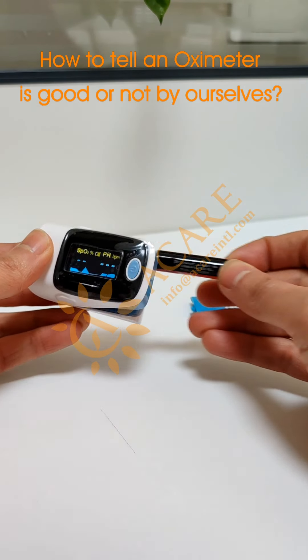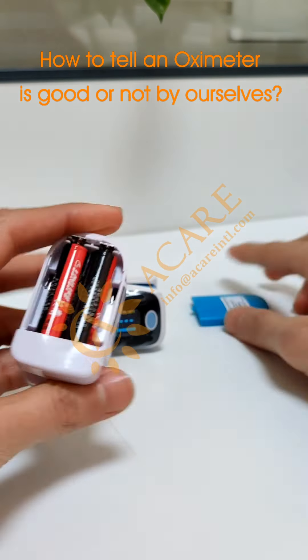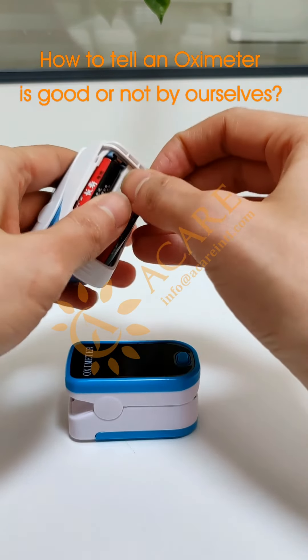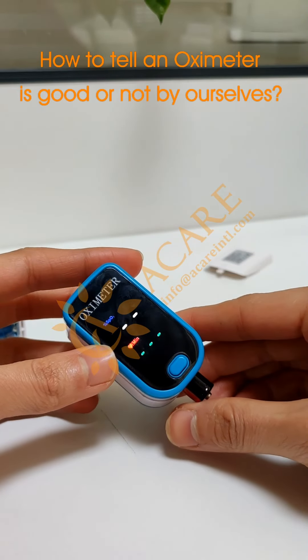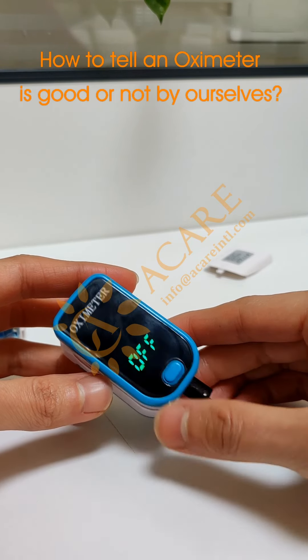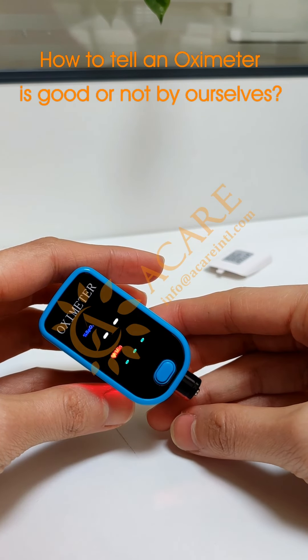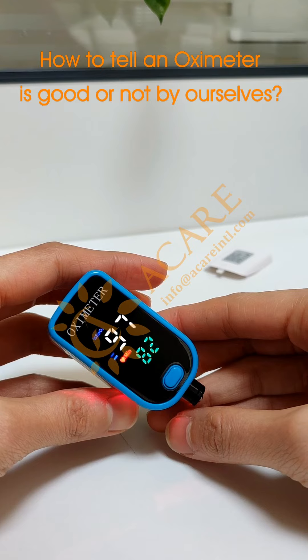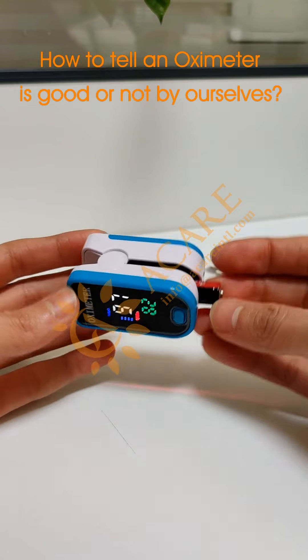Now I will put that aside and test this one. I don't have enough battery here. See what happened — it can show results even on a battery.